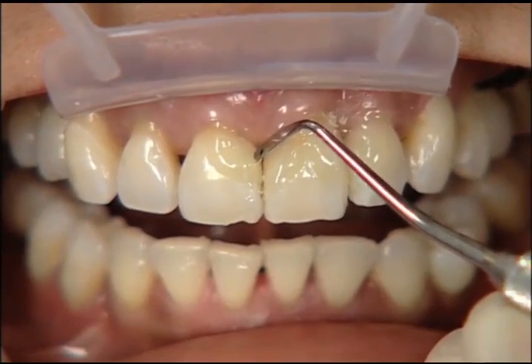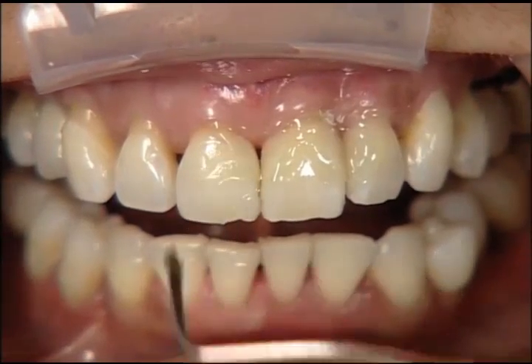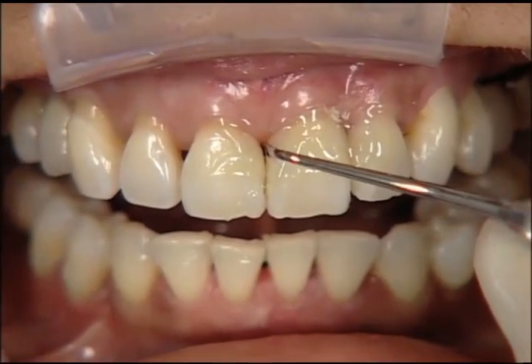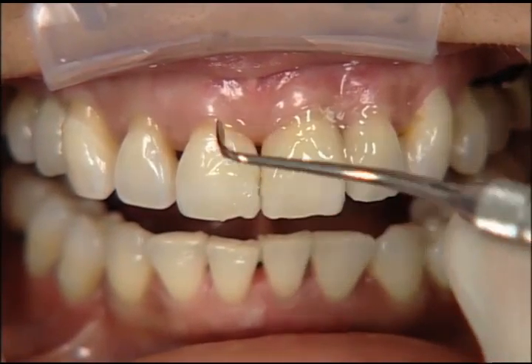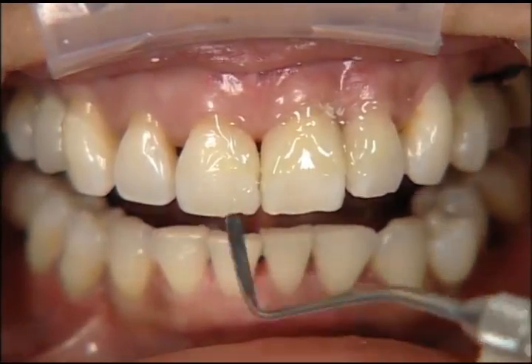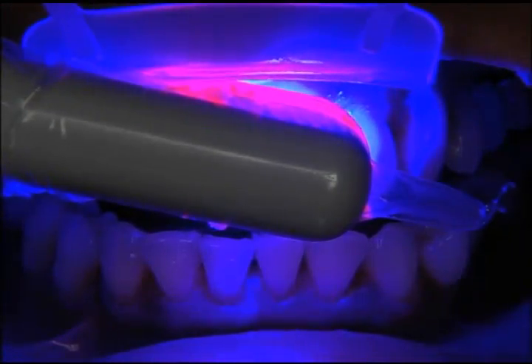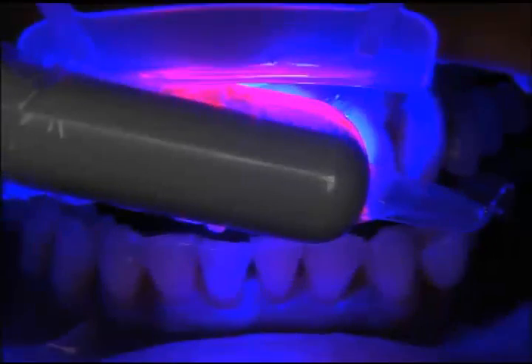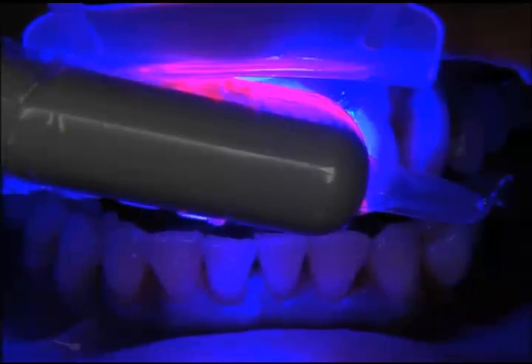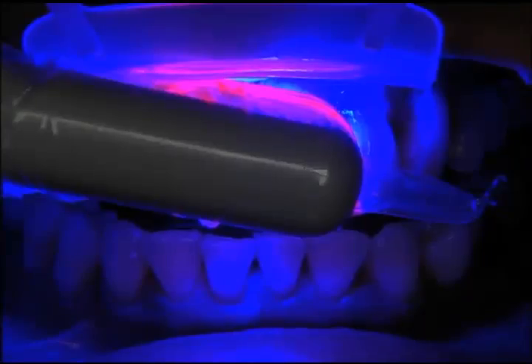Now we're placing the interproximal veneer on the mesial of tooth number 8, again using our class five instrument to manipulate it into place. We started off with a pretty huge gap between those two teeth, so any reduction in the size of that open gingival embrasure is a step in the right direction. Even if you're not able to close the gingival embrasure completely, the more you can close it, the less of an embarrassment it will be for the patient and the less food that will get caught. On somebody who's already had periodontal surgery, you want to be careful not to square everything off so much that it's not a healthy situation for the gingiva.